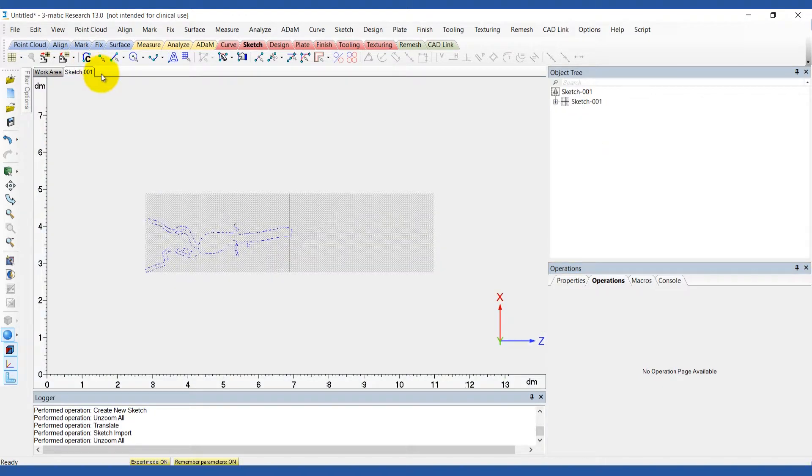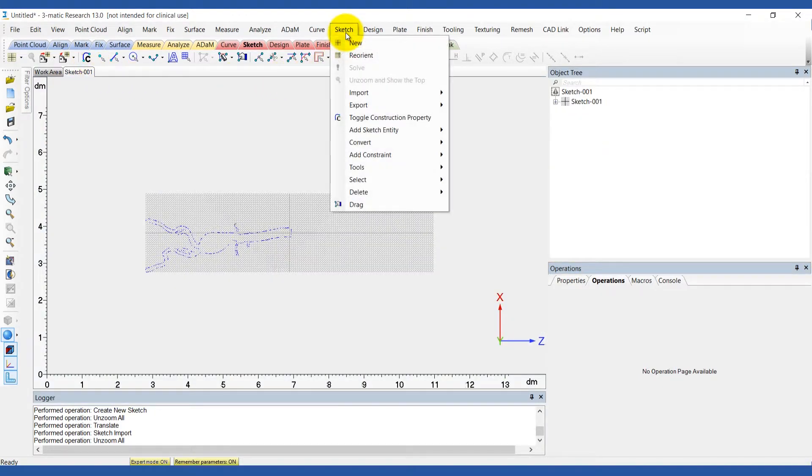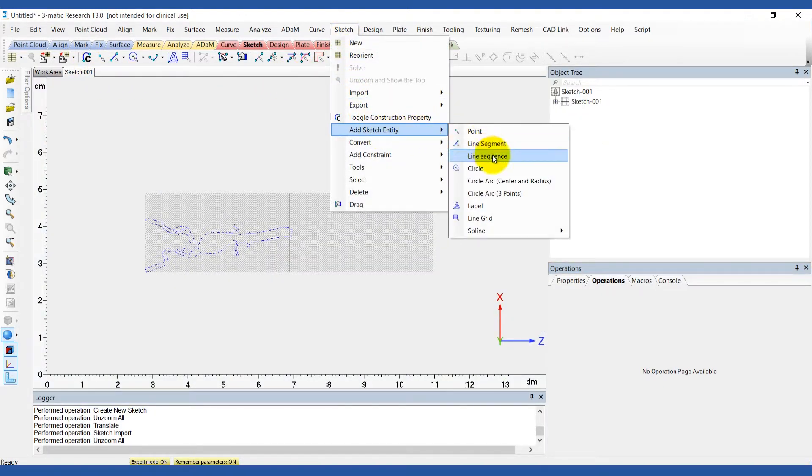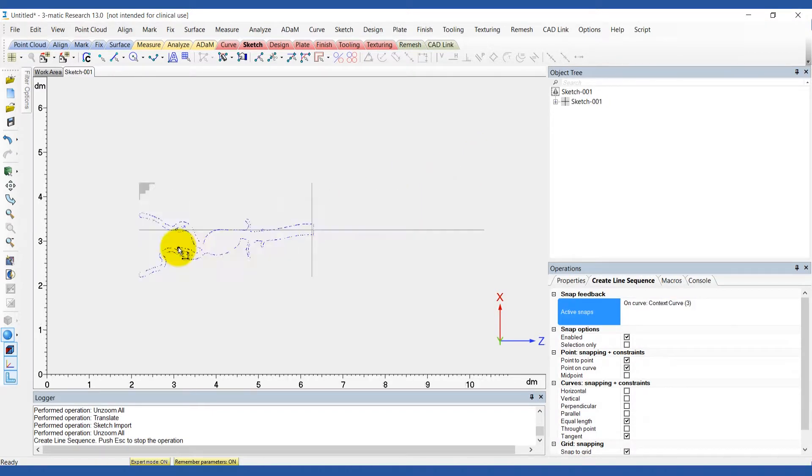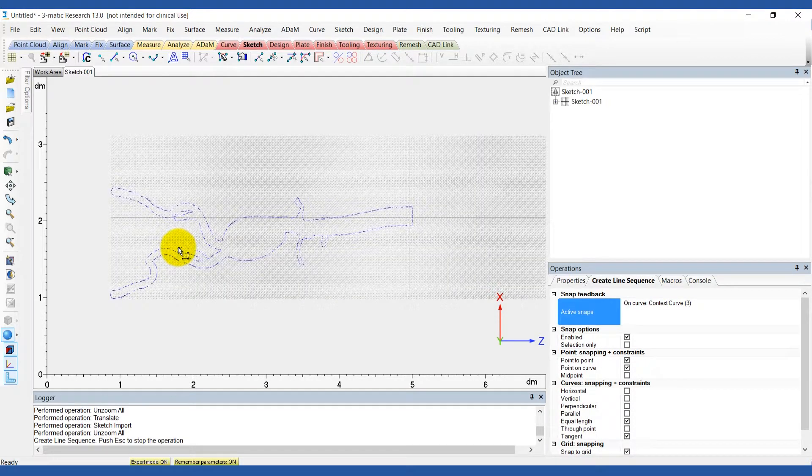Now use the create line sequence to draw a profile of the base. Make sure the entire profile of the aorta is included within the base.